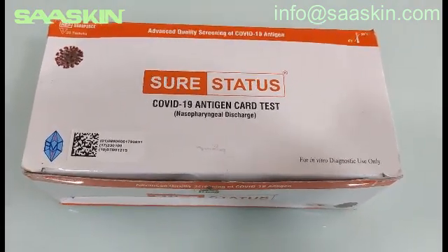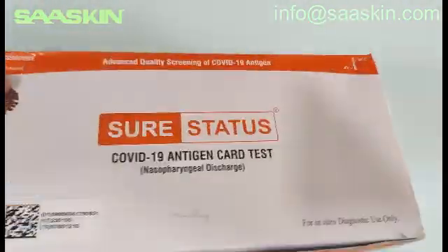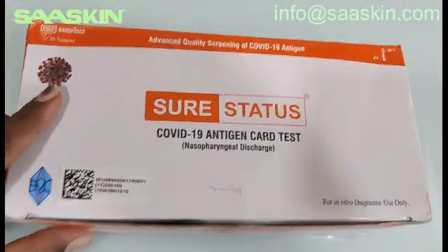Let me quickly unbox this for you and show you the box around. This is the top view, this is the front view, here are the kit contents, and here is how the total box will look like.